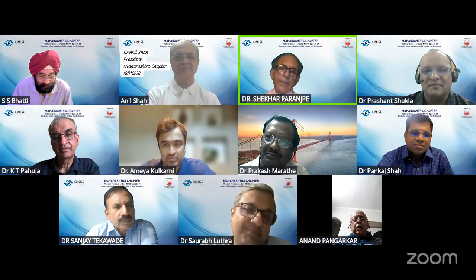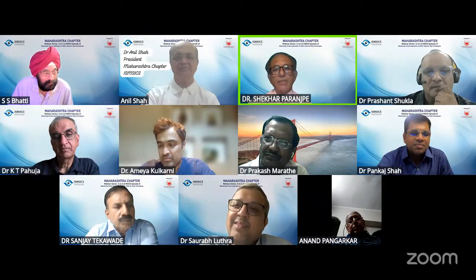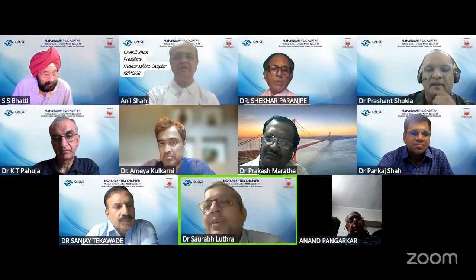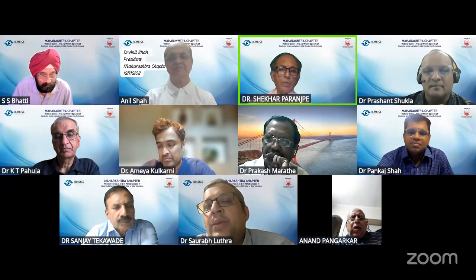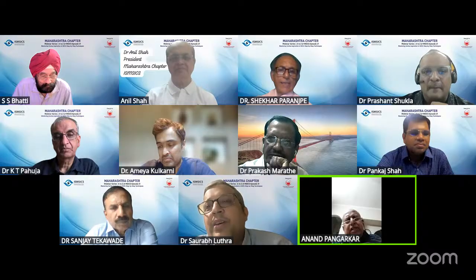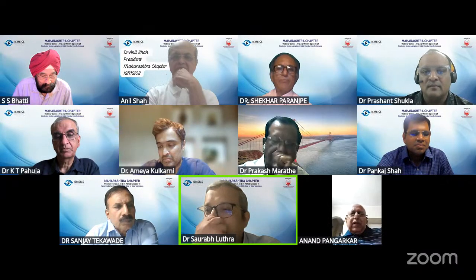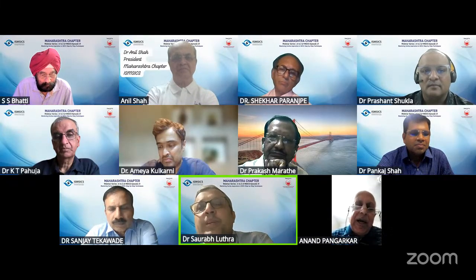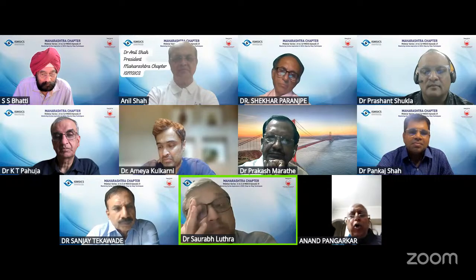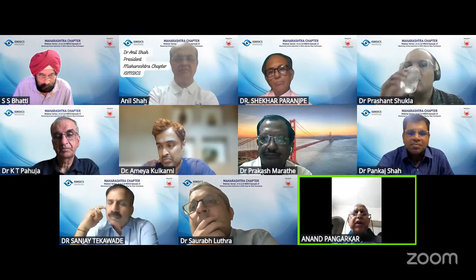One of the main advantages of CCC and in the bag implantation is very good refraction stability. That's true. It doesn't move forward. All these premium IOLs and all the calculations will only work with these CCCs and an effective ELP planned. That is only possible with these newer technologies, and no change in effective lens position years after. True.